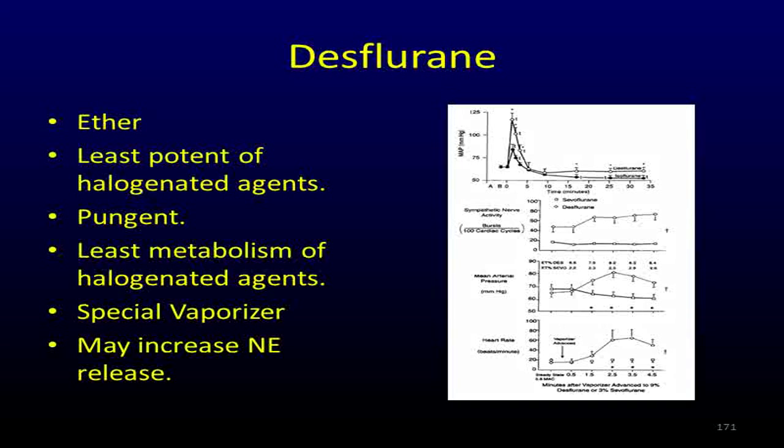The soda lime is that little white mesh that scrubs up all of the CO2 on the side of the anesthetic machine. It looks like cat litter, but if you take it home and your cat uses it for cat litter, you'll burn the crap out of the bottom of their feet. It's very basic. So when desflurane interacts with that mesh, that white soda lime, it seems to create carbon monoxide. So carbon monoxide levels in the blood may go up. Make sure you write that down.